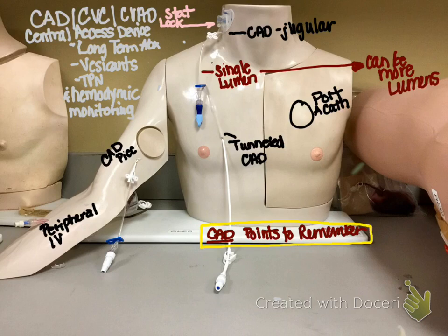There can be more lumens. Just some points to remember. You want to change the dressing every 7 days per hospital policy. It really depends. Sometimes there's an IV team that does it. Sometimes you do it. And sometimes you do it more than before 7 days. Why would you do that? Well, let me tell you.